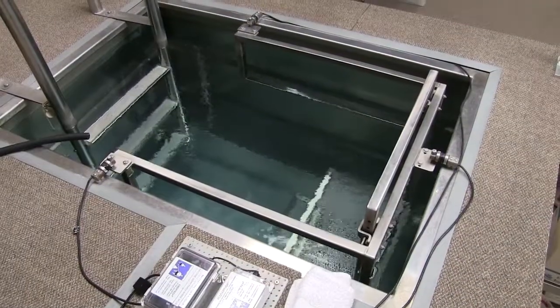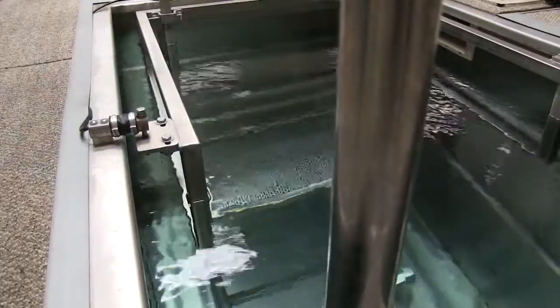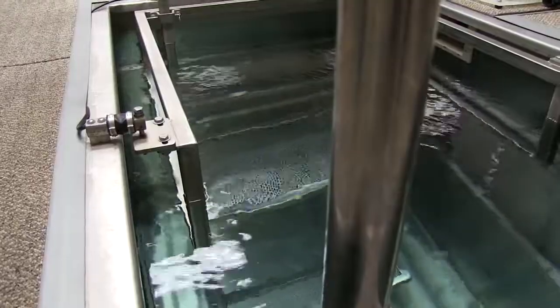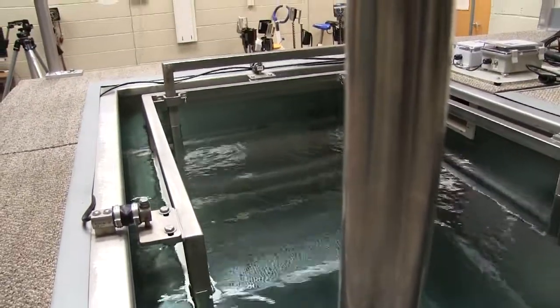The procedure you watched is typically repeated several times until a consistent density value is achieved. Subjects will learn how to properly exhale the air from their lungs and typically achieve a higher density value with practice. Let's go ahead and see what's going on at the surface — this is a pretty quick exercise.